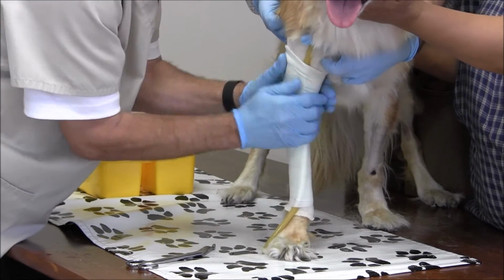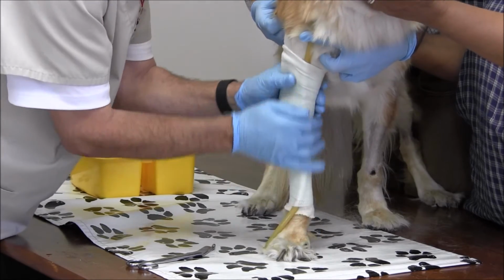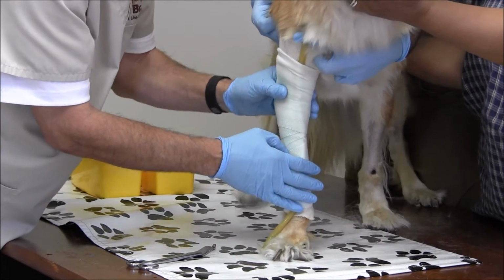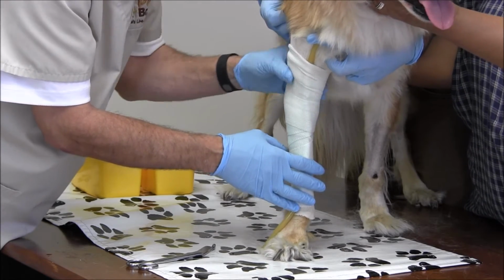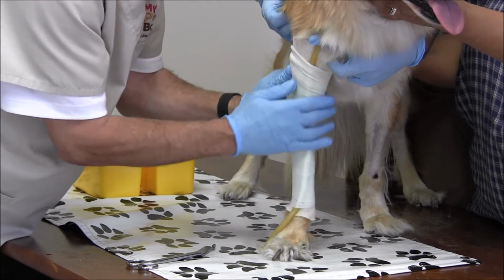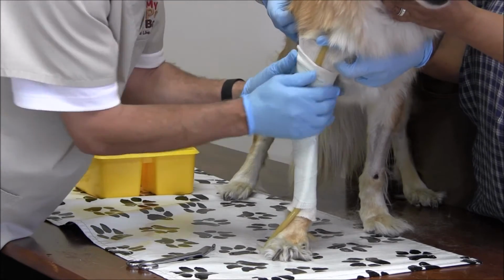And we want to rub in the fiberglass very well. Last thing we want to do is just come in right above the humeral condyles and squeeze in there slightly. And that will give us a good impression and help in suspension of the brace.